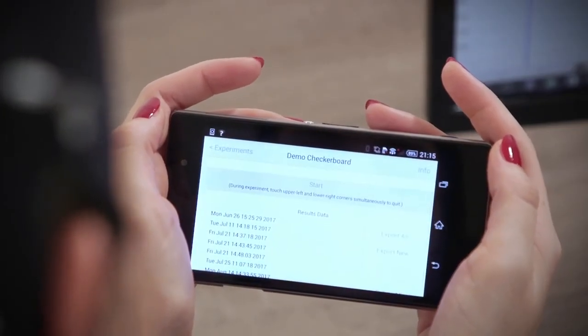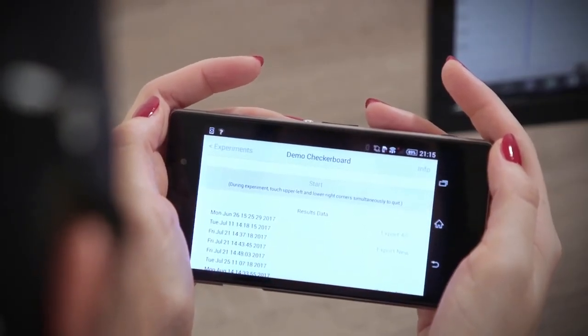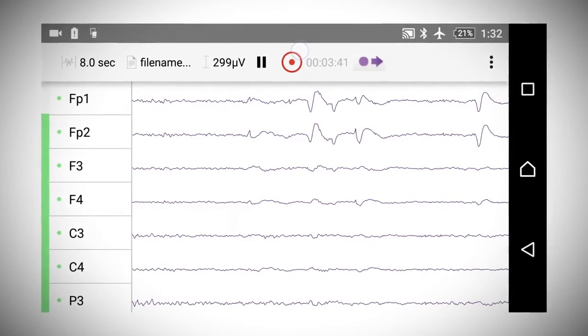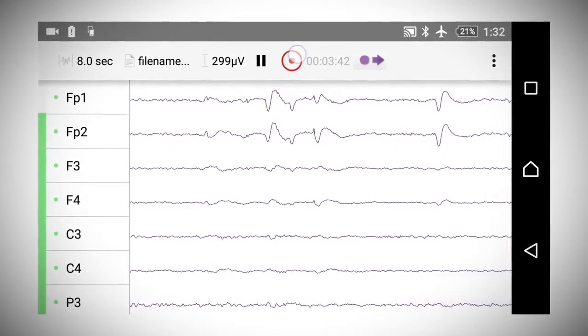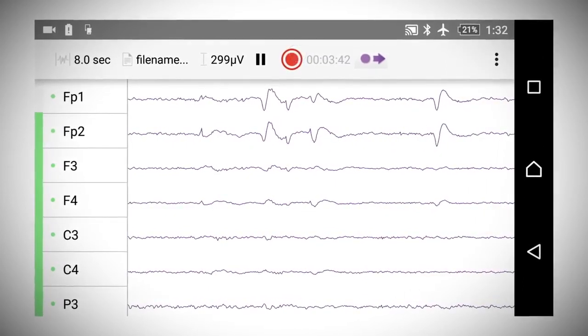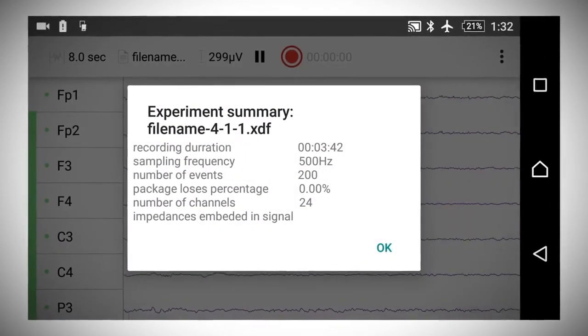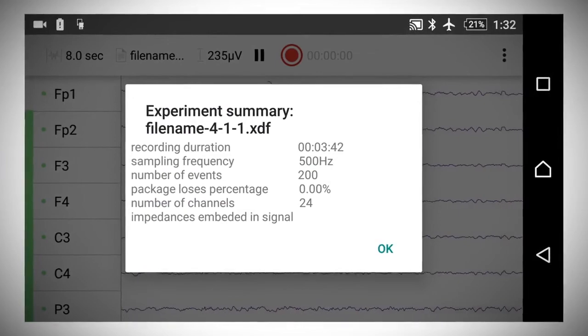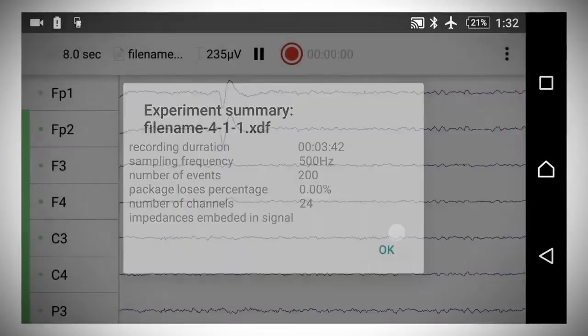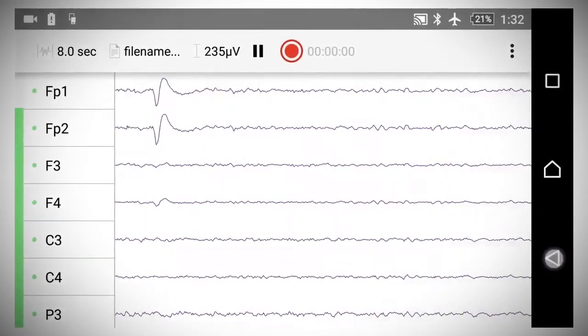At the end of the experiment, click record button in the Smarting app to end the recording and read the experiment summary. The number of events will be a good checking point for the experiment.